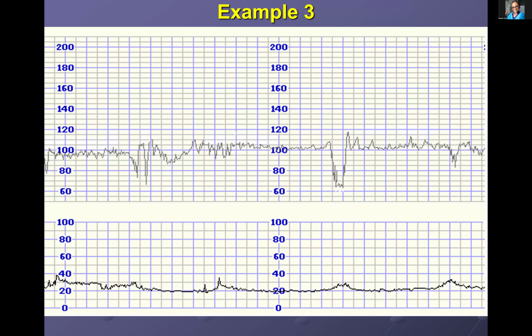But it looks like it's also descending to a 90. It does. You're right. So of course you're not fully reassured about it. Okay, so that's your BRA, your baseline rate.